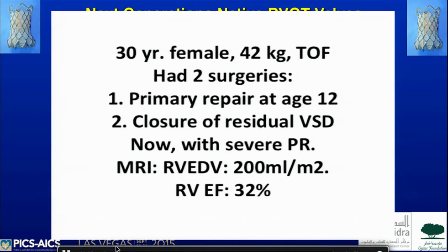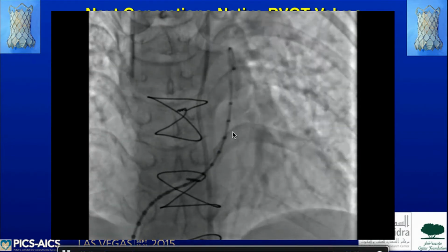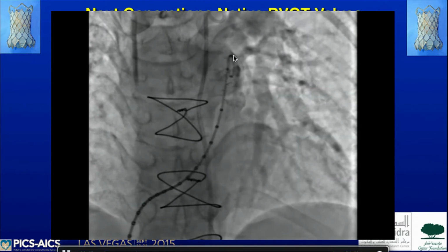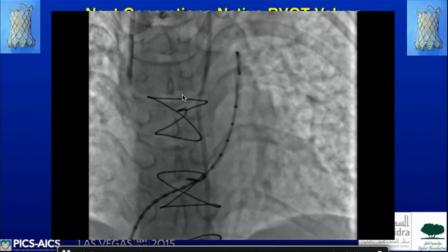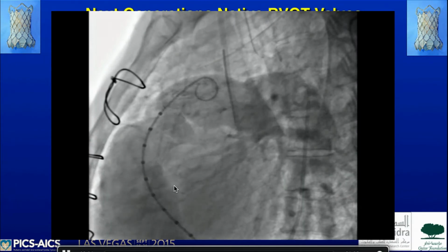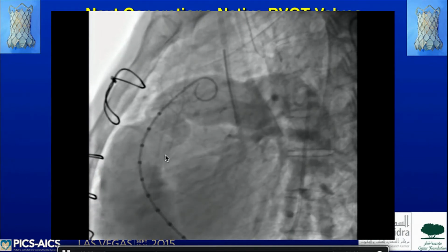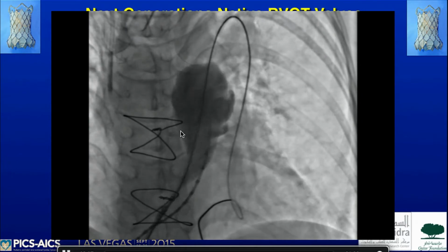Took her to the cath lab. This is first in human in May 2013. I did 2 cases in Shanghai. So there is the outflow tract here, severe PR, with the RPA and LPA almost wide open. This is the lateral projection. Basically, it's a self-expandable valve, and does not require any pre-stenting, similar to the other 2 valves.